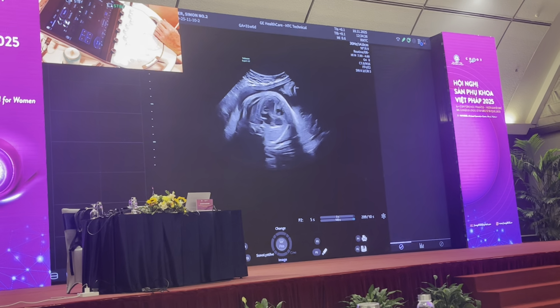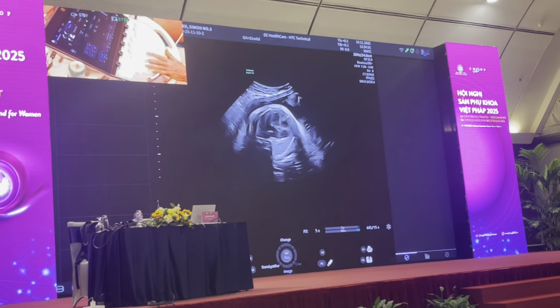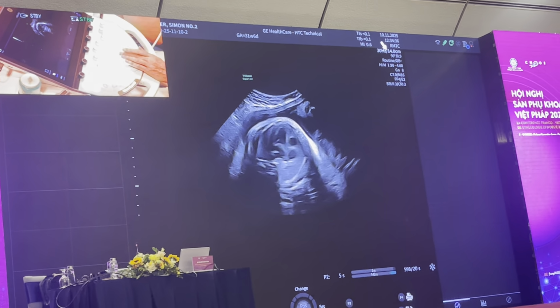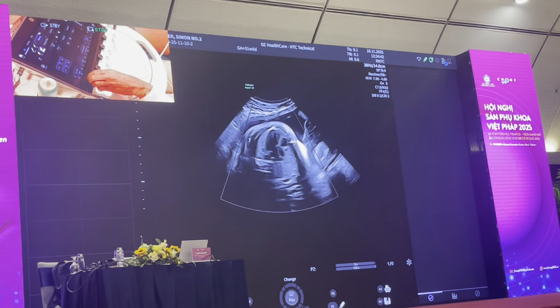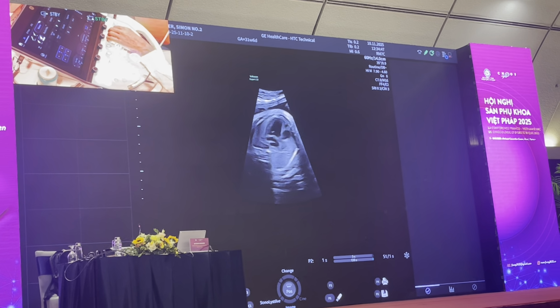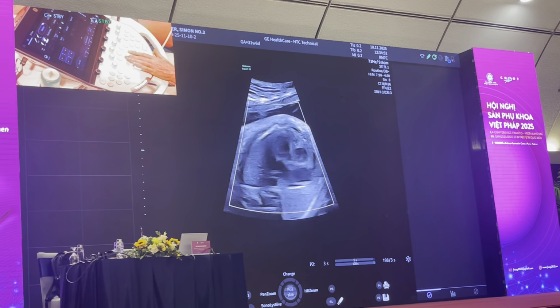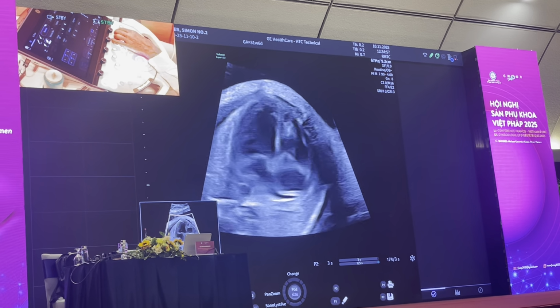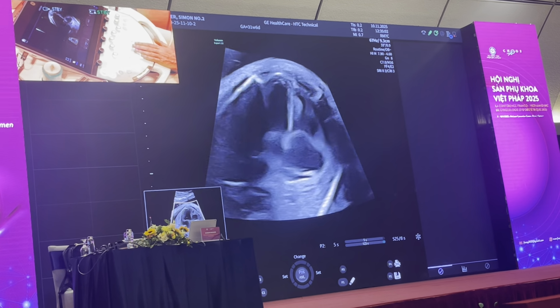With regard to evaluating the baby's cardiac anatomy, the first thing I do is take down my sector width. If you look here, my frame rate is at 30 hertz. When I take my sector width down, you will see that my frame rate now jumps up to 52 hertz, maybe more. Then I reduce my depth. It's exactly the same as when I did the scan in the last patient. I'm now firing at 67 hertz, and in this baby it is a very magnified image.